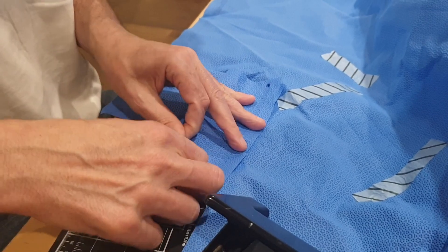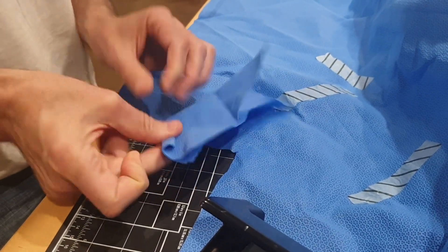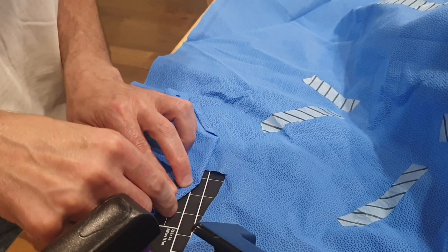Roll back the other corners in order to create a seal. And now staple the folded edge to secure it. Repeat the same procedure on the other side.